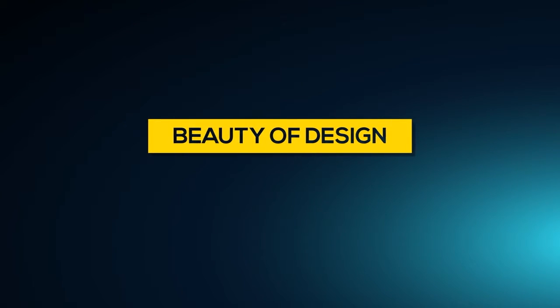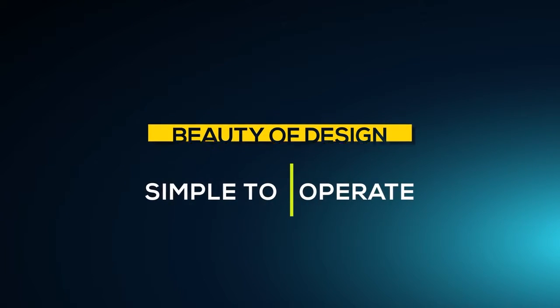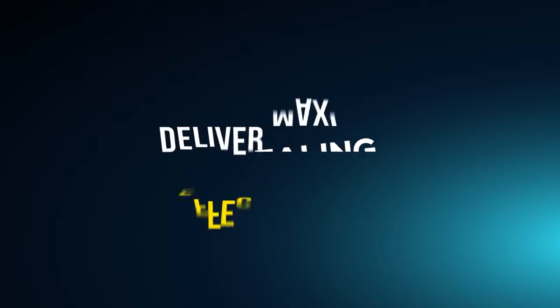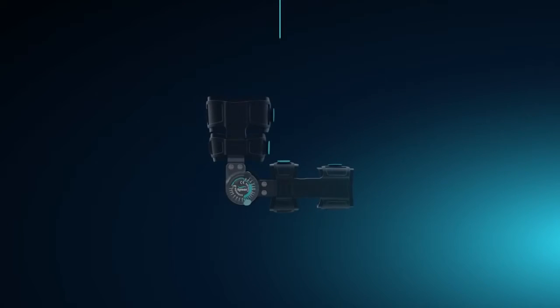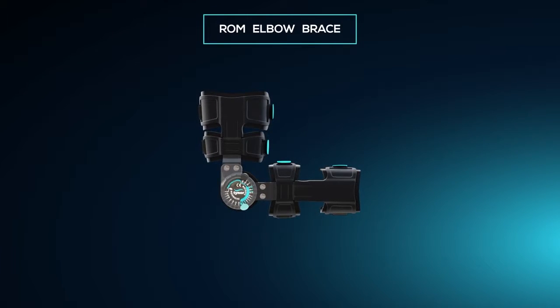The beauty of design is when a product is simple to operate, appealing in looks, and delivers maximum effectiveness. Tynor brings you this beauty in the new range of Motion Elbow Brace.